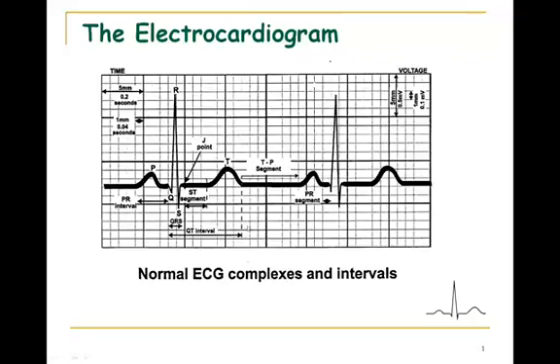One thing I want to emphasize is that anytime there is current flowing, you will see deflections in the EKG, say an upwards or downwards deflection. At these baseline points in the recording, there is no current flowing. There is no potential difference being measured through the heart.